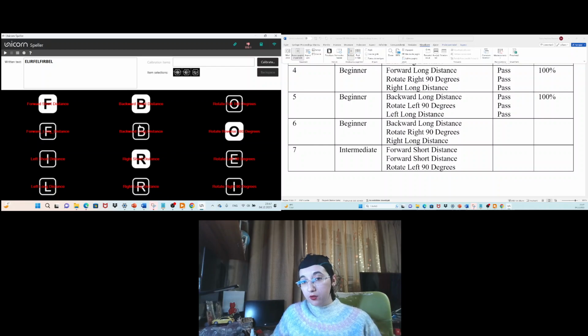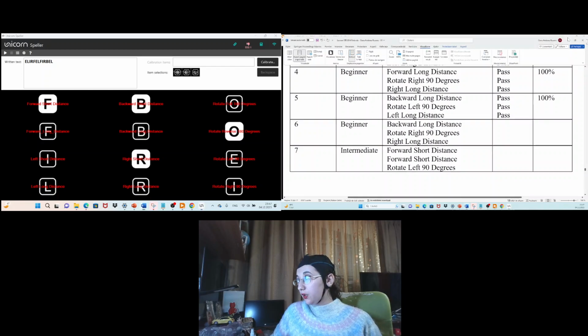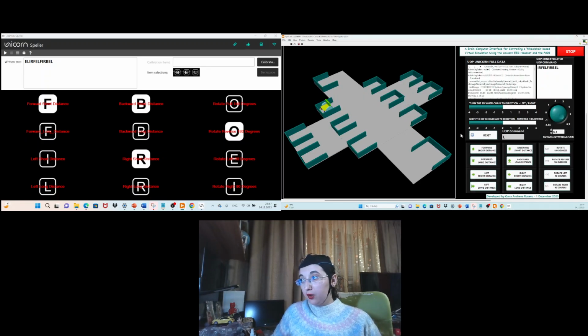So backward long distance is the first one that I will focus on, then rotate right 90 degrees, and then right long distance. So I will try to remember them. This one, and this one. Let's begin.